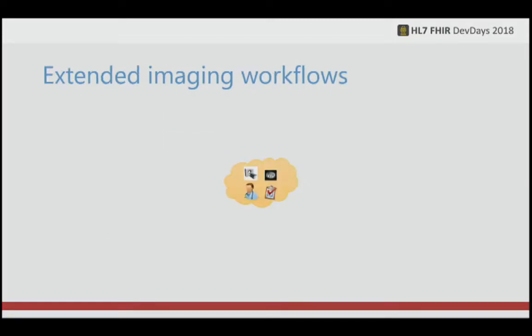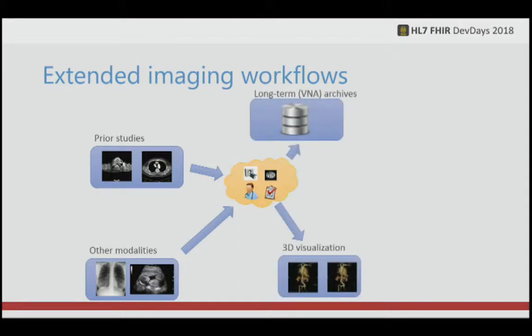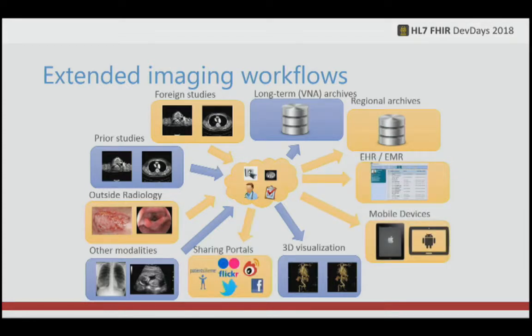It goes much beyond this, though. There's a number of extended imaging workflows. We think about bringing in prior studies, we're looking at other modalities. We want to send them to VNAs, long-term archives. We want to do 3D rendering on those images, reconstructions. We want to bring in foreign studies or outside studies. We want to look at regional archives, national archives. We want to get these things into the EMR.